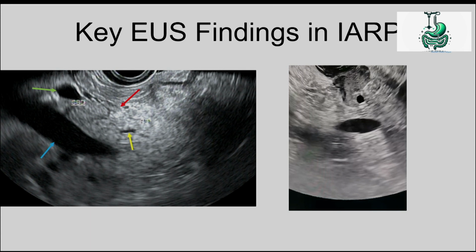And this one is also from last week, a patient admitted with acute pancreatitis. We did a CT and MRI and they turned out to be normal. But we did an EUS. We found a small lesion. Unfortunately, the video is not working. So it's a small lesion. We took a biopsy, and it turned out to be adenocarcinoma. And it had been read by 2 senior subspecialized radiologists. So they missed this diagnosis, and the patient was lucky to go for surgery.